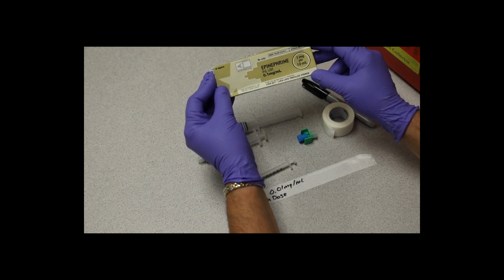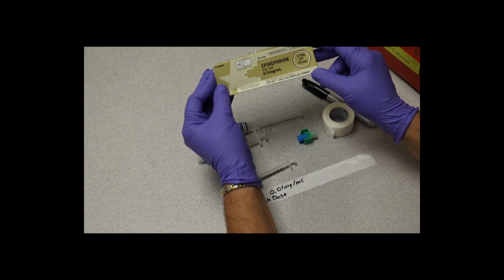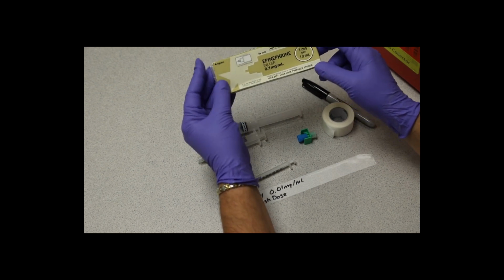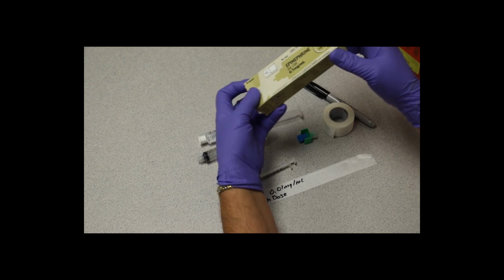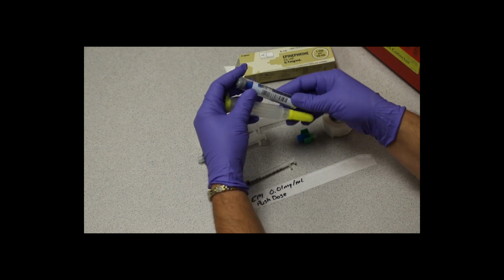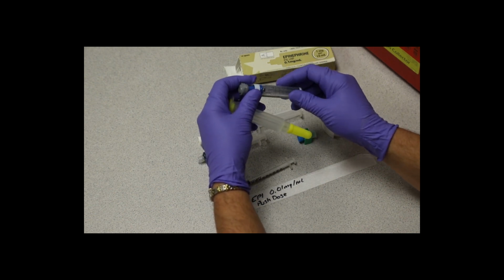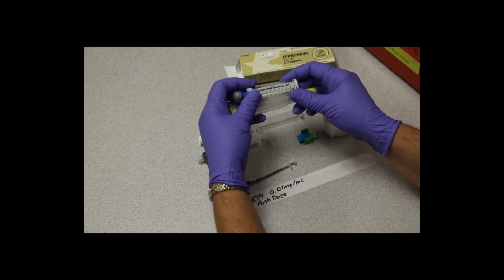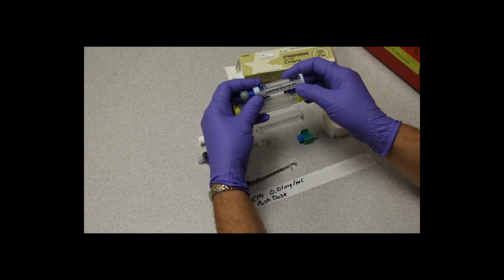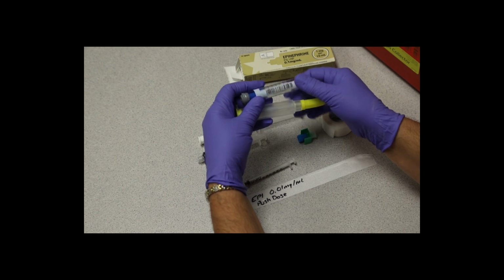As I de-dice my medication, the drug is epi. The dose is 0.1 milligram or 1 ml to be diluted. The integrity of the container is intact. Color and clarity is good. There are no floaty things and it's nice and clear. Concentration is 0.1 milligram per ml. And it's not expired.